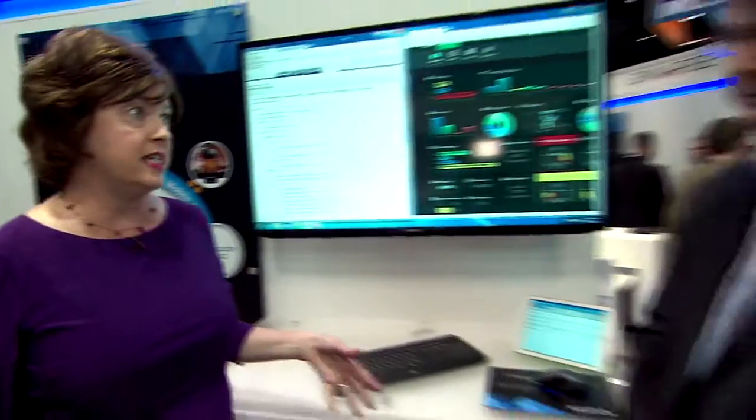Other areas might just be a traditional shared drive in a department where, again, you either bring up our browser-based tool or you integrate through an API directly into an application in a department, and that's another way of capturing non-DICOM.